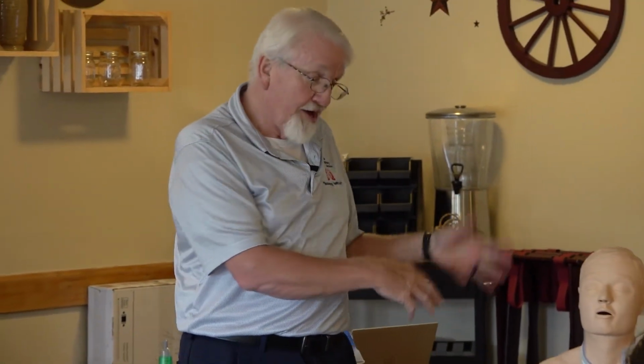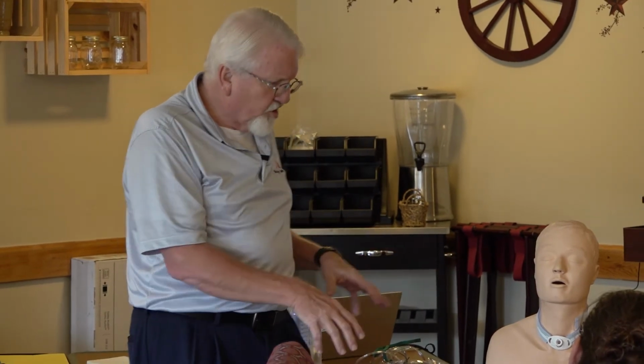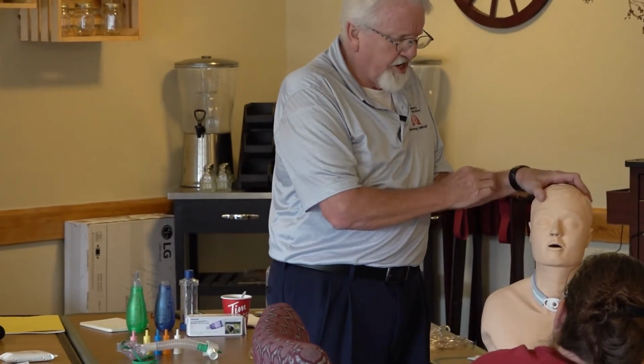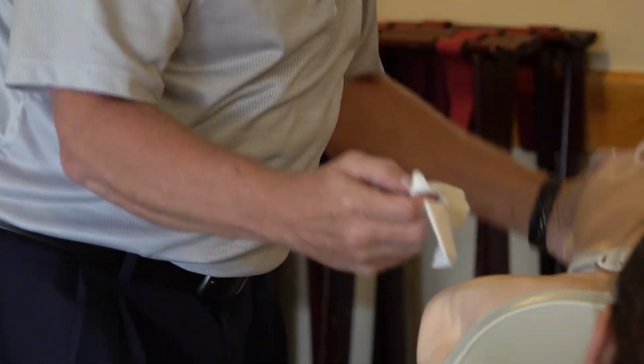So what I do is say, Bob, okay, I'll take care of it in a minute. I'm just about done here now. Let me get all done and we'll take care of that for you. He says, okay. So I go ahead and put the new split sponge in.